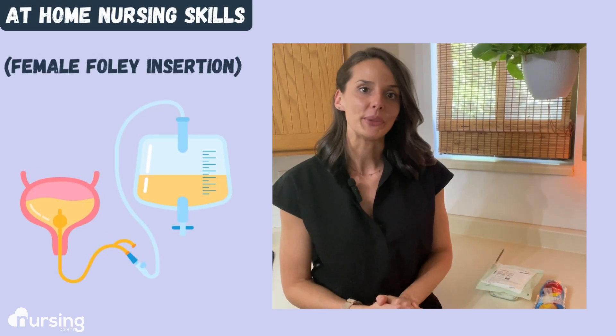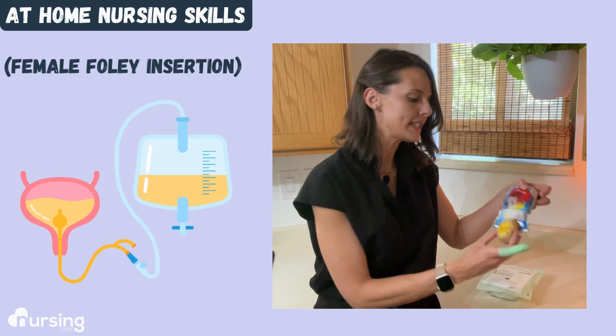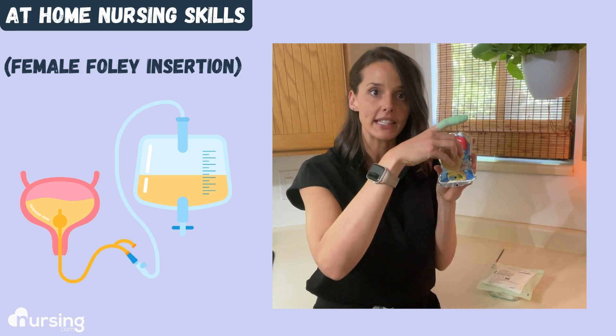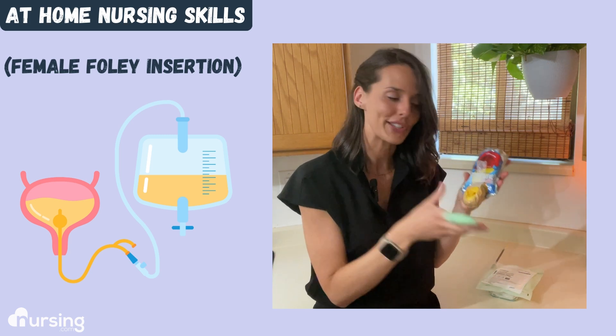Hey everyone. I'm going to show you how to practice Foley insertion at home. I put together a Capri Sun with an overcooked potato with holes cut in it to simulate inserting into the urethra so that I get urine return.